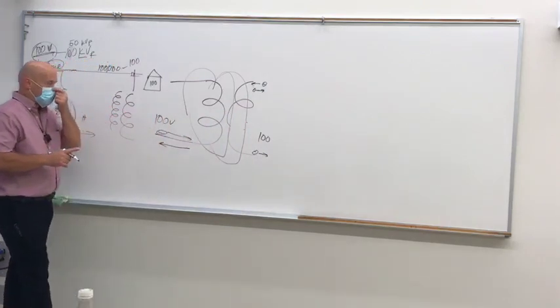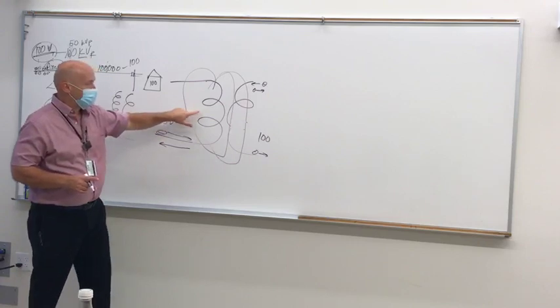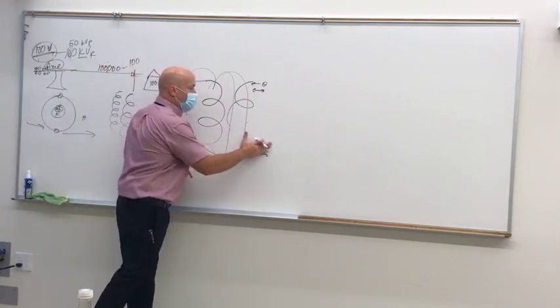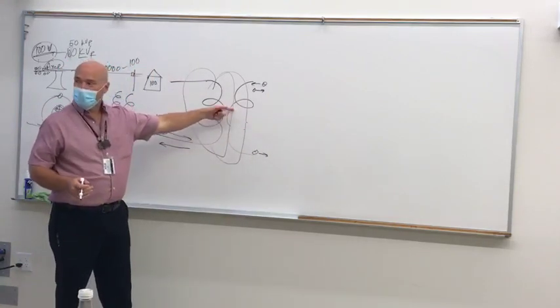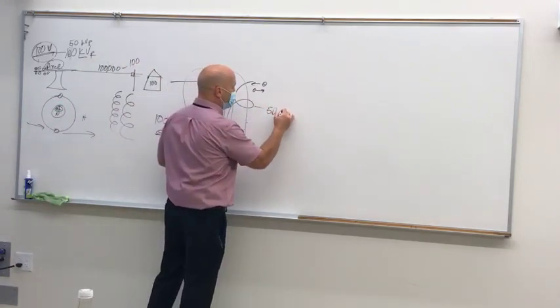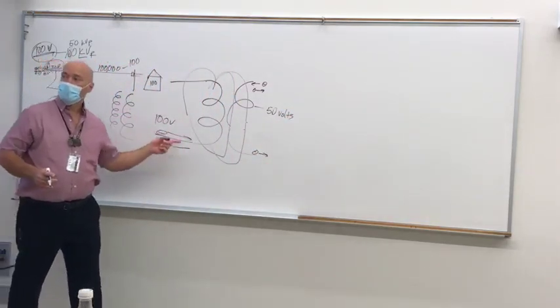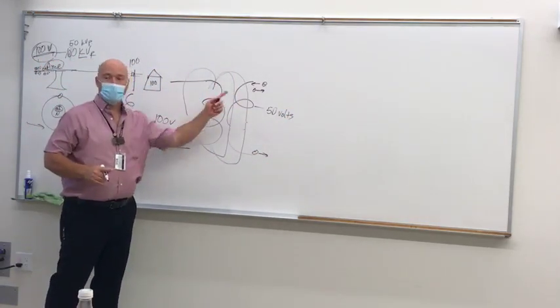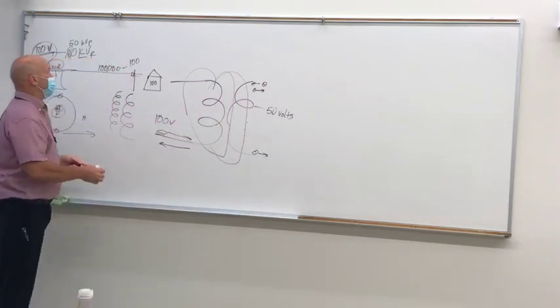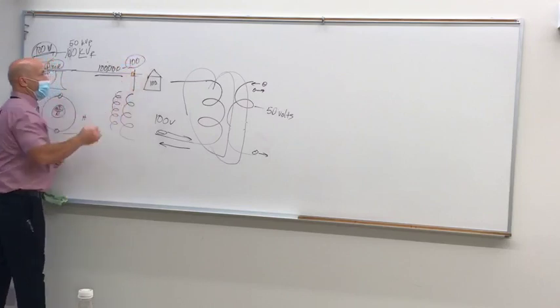What that means is that if I supply this with 100 volts and it's got 2 turns, bingo, very good, you're catching on quick. So what I have over here is 50 volts. Okay, it's a direct proportion. I've cut my turns in half, I've cut my voltage in half. Now, let's go back to this. I have 100,000 volts, I need 100 volts.